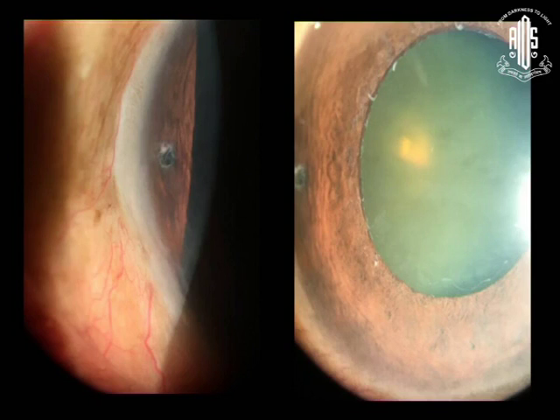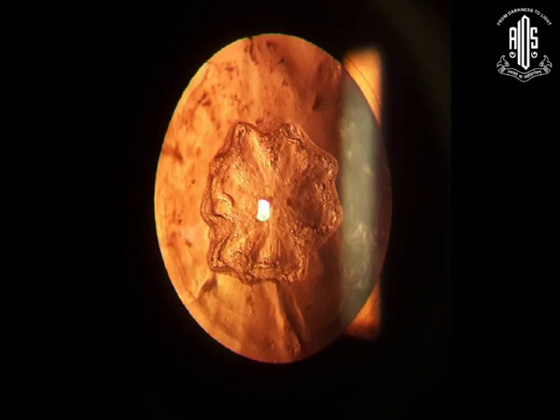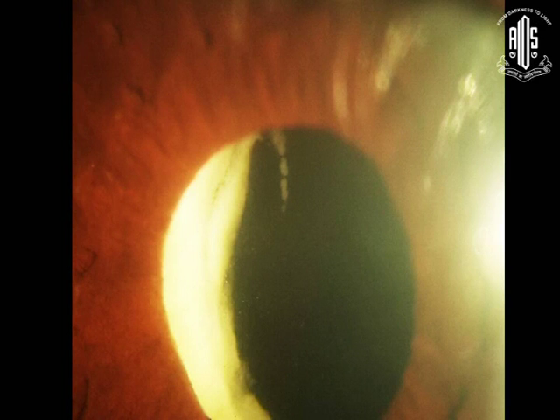Just to show you some pictures, the quality of which we can take with this. This is a patient with an iridectomy. You can see the iris, the fibrils here, and also the changes of pseudoexfoliation neatly documented with this technique. There is a congenital cataract in retro-illumination. There is a feathering of the posterior capsular area in a gas-filled eye. And this is Candida endophthalmitis. You can see the budding nature of the organism in a pseudophakic eye.